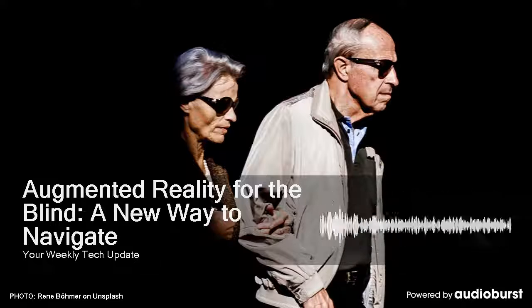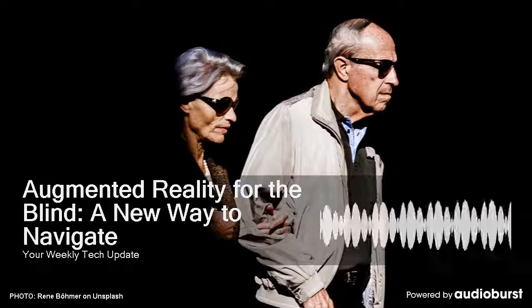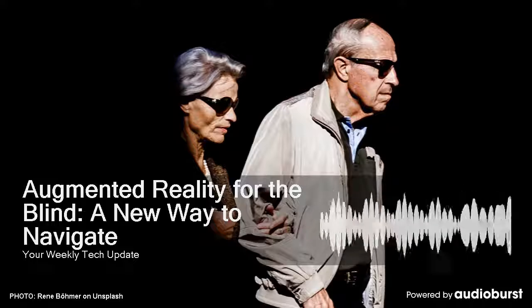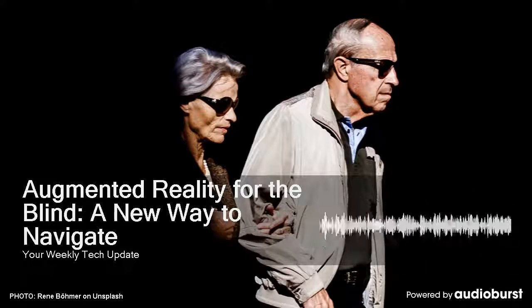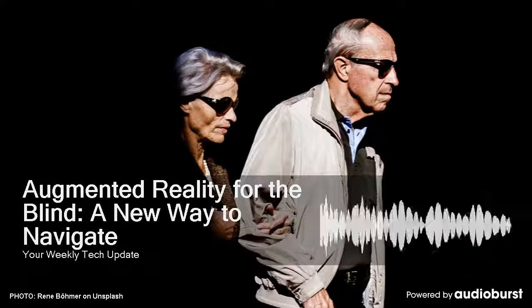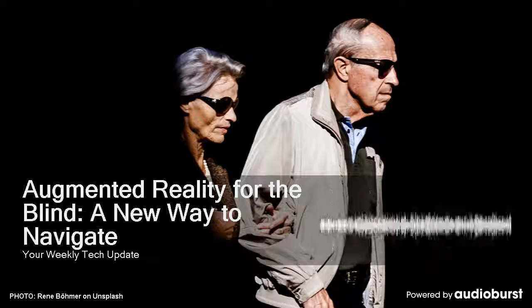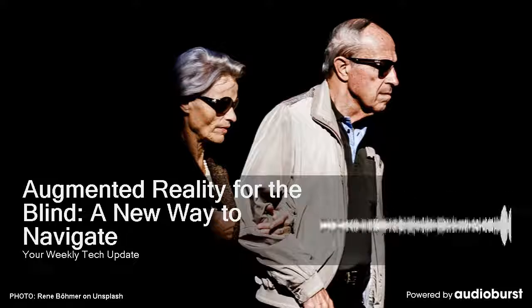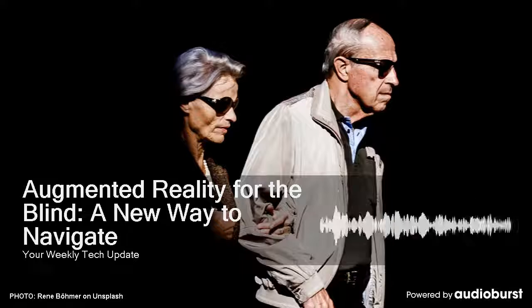To test Kara's practical applications, the researchers designed a test route for blind volunteers through the Beckman Behavioral Biology building at Caltech. To prepare the task, the scientists first developed a route through the building and followed it while wearing the HoloLens, which scanned the environment and saved it to memory. Then the blind volunteers were asked to navigate the same route using Kara as a guide. Led by Kara, all 7 of the volunteers completed the task successfully on their very first try.